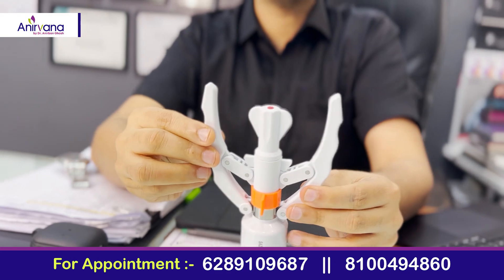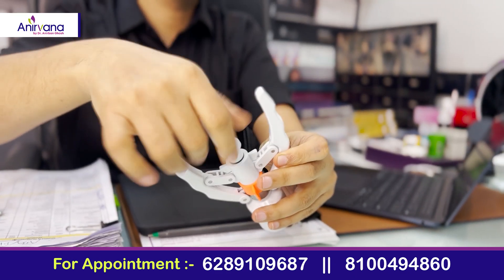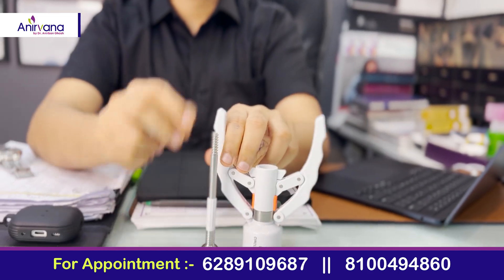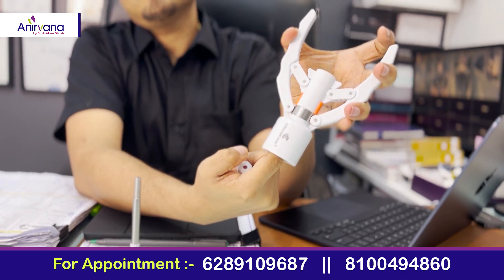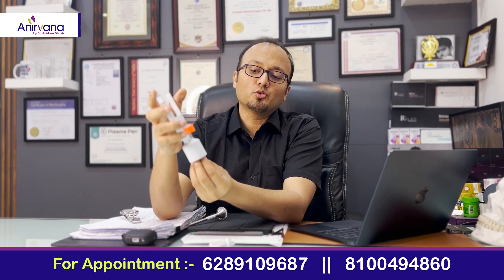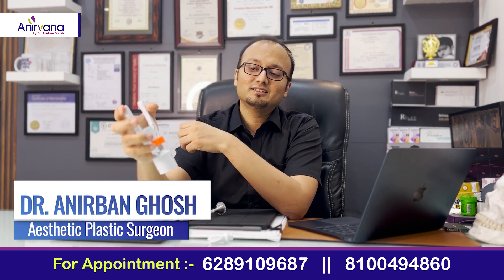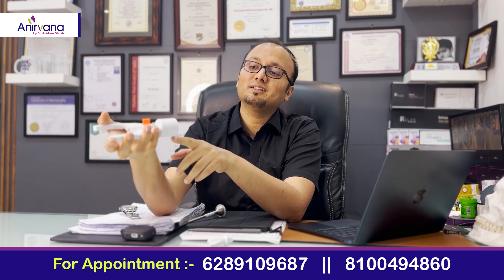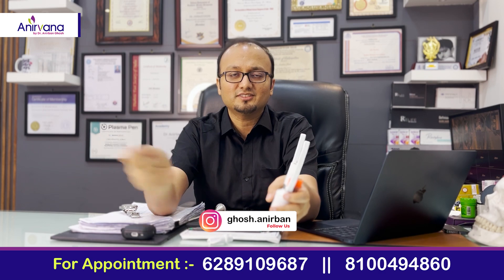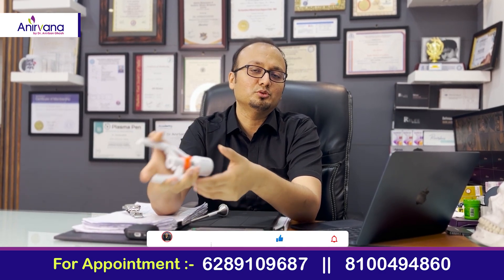This is the device — it has a key. This is the anvil, which goes into the penis, and this is the handpiece. What you need to do is fix the foreskin inside this machine and press it. Once you press it, the staplers fire and seal it, so there is no involvement of any kind of stitches.